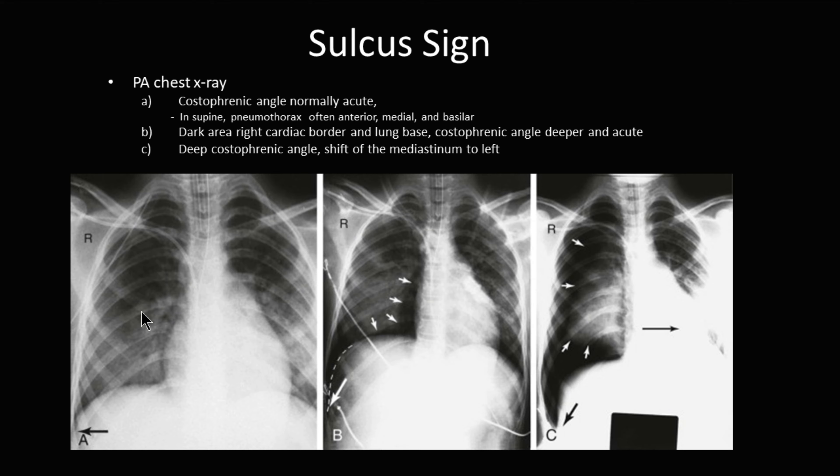Sulcus sign can be a clue that you have a pneumothorax. You can have a pneumothorax without a sulcus sign; however, if you have one, typically this indicates a pneumothorax. Here you can see a normal costophrenic angle compared to this side, where the costophrenic angle has now increased.